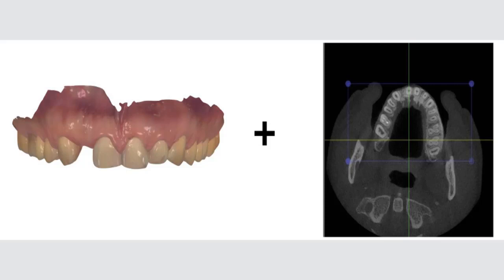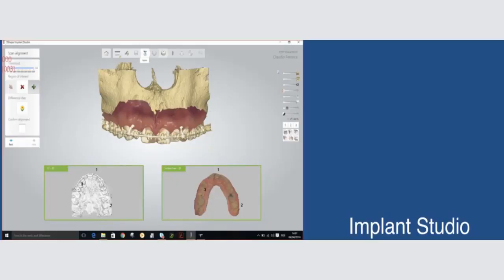They are large files, just keep that in mind, but you need to ask the place that you have the CBCT from, or use your own CBCT if you have a large and very busy clinic. Then what you're going to do is integrate all these components, the scan and the CBCT.